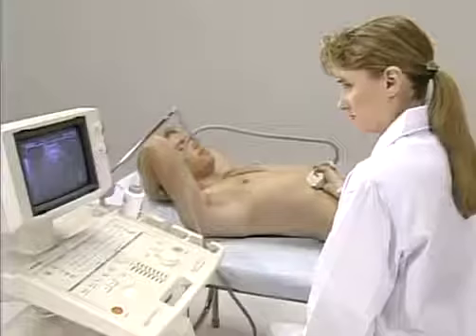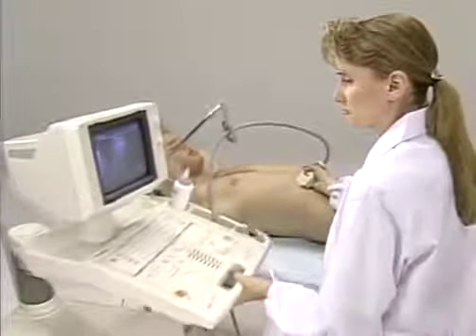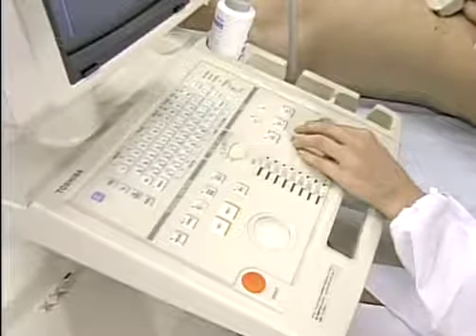To obtain images which meet these conditions, needless to say, it is very important to adjust the ultrasound system correctly. Now, shall we try to adjust the system? First, we arrange the equipment for examinations. Place your left hand near the gain knob, then arrange the operating panel so that you can reach any key quickly as needed.